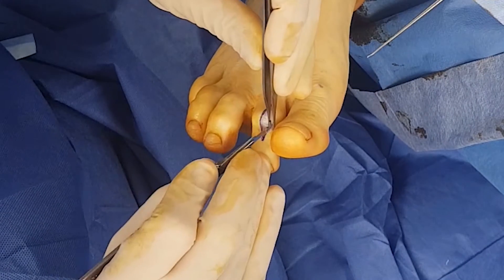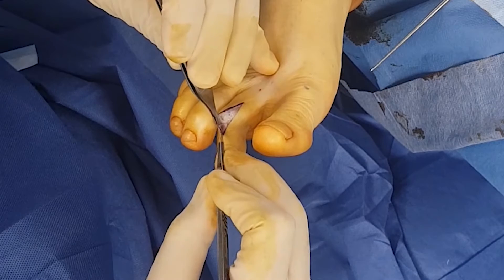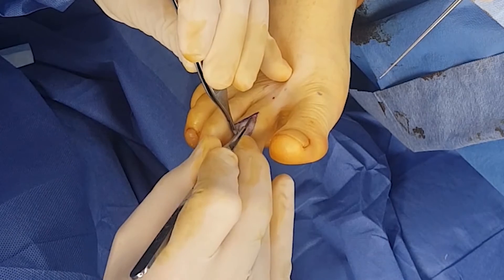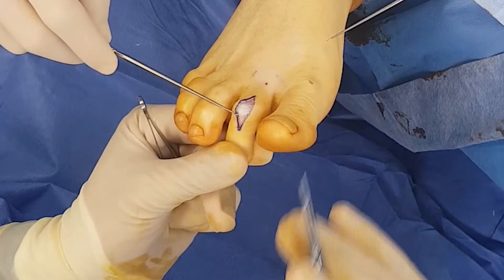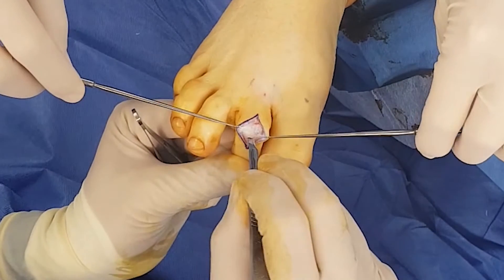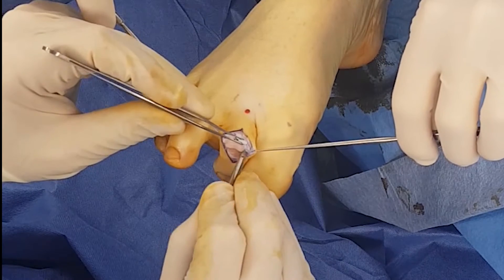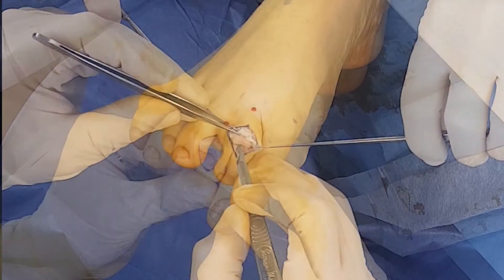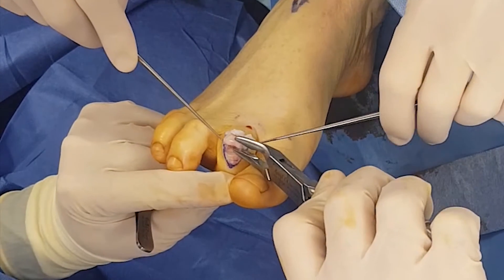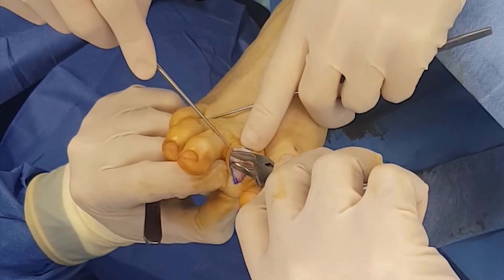Once the skin is removed, you just use the 15 blade to underscore the superficial fibers that are attaching the dermal layer to the superficial fascia. My surgical assistant has the skin hooks just to retract the skin away from the superficial fascia. We're cutting into the extensor tendon through a transverse incision just to expose the PIP joint. We're now releasing the joint capsule, and you can see that the joint is now exposed. We are using the rongeur to remove the articular cartilage from the head of the proximal phalanx and also the base of the intermediate phalanx.